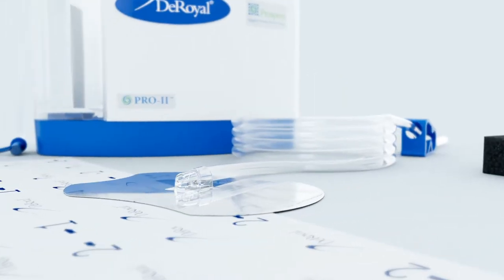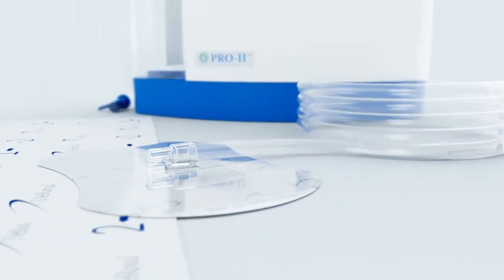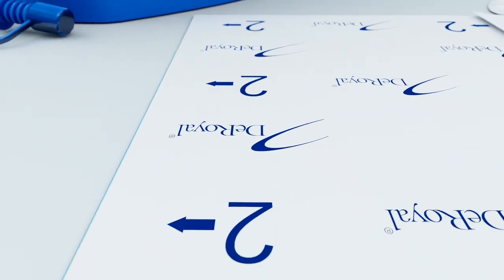DeRoyal's Prospera negative pressure wound therapy device and dressings are indicated across a variety of wound types. This video will overview the application of the Prospera Pro dressing kit and Pro2 NPWT device.